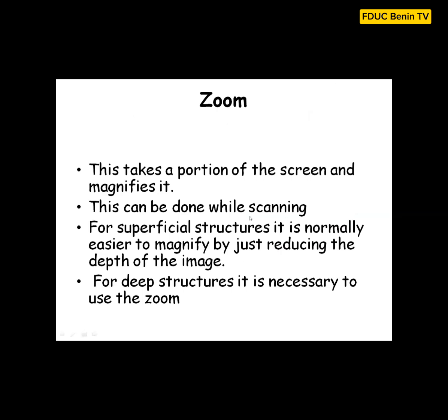If a structure is superficial and you want to magnify it, you can combine both the depth and the zoom button together, and it will help you get the structure to fill the screen as you want, so that you can really see all the details properly.